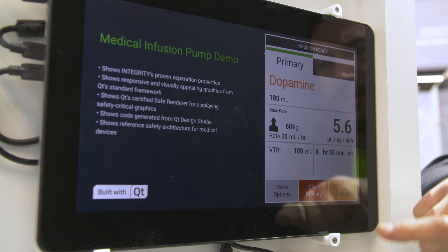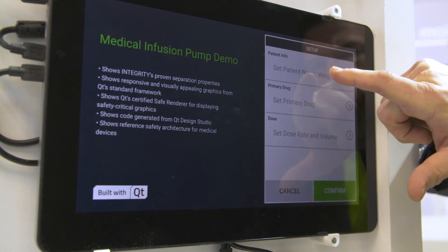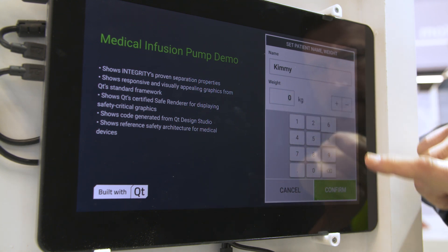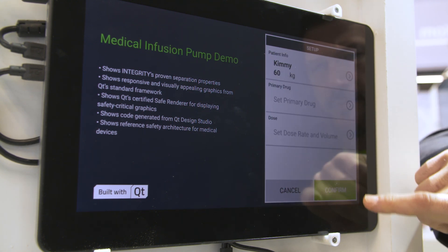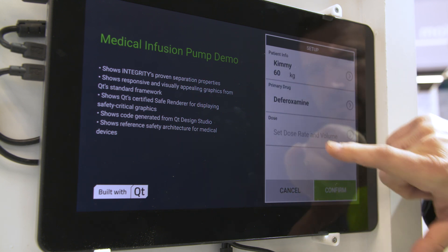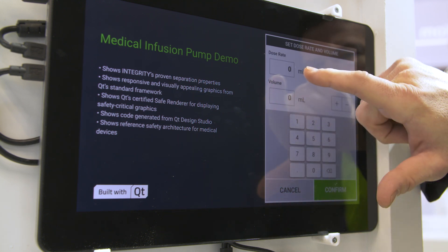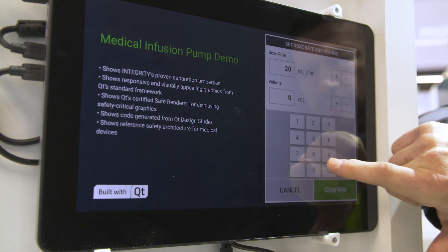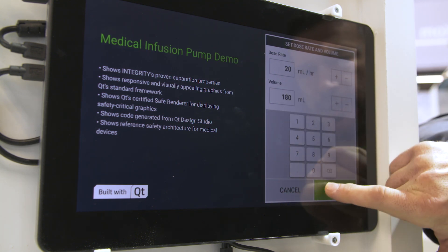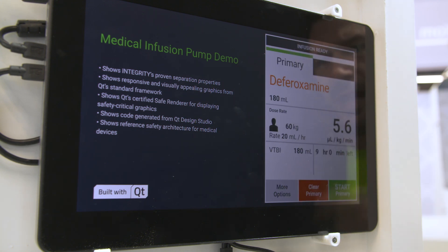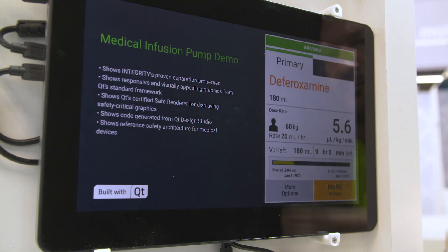This is simulating an infusion pump. I can come in here and put the patient information in, including the patient's name, their weight, what drug we're going to infuse, and the rate at which we will infuse the drug. It's very dynamic with nice touchscreen operation, and when we confirm it, we're now simulating the drug being infused.